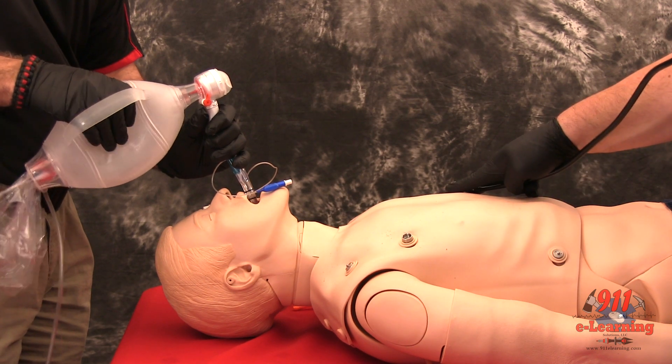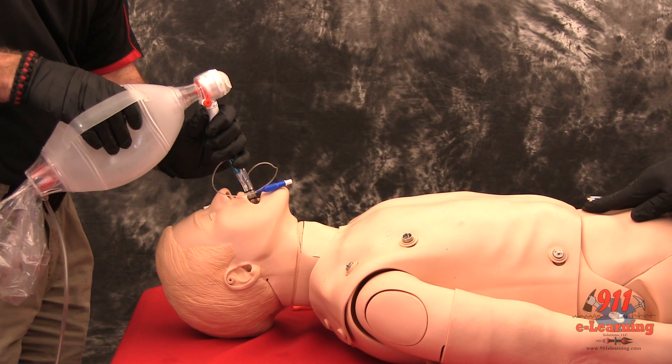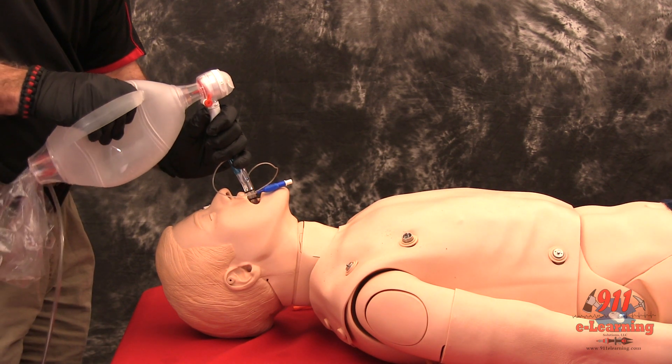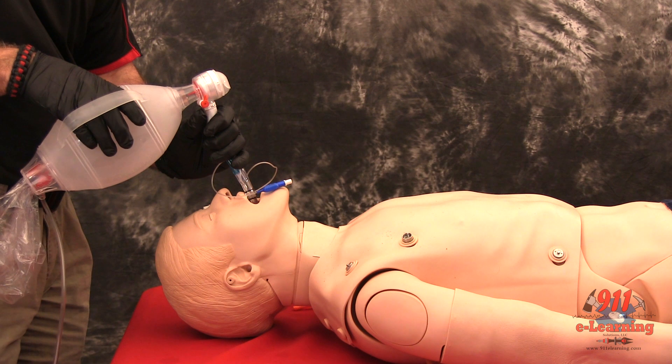In the esophageal mode, stomach contents can be aspirated through the number 2 or white tube, relieving gastric distension.